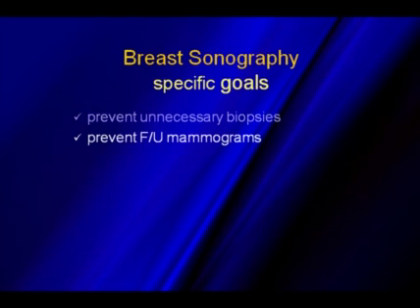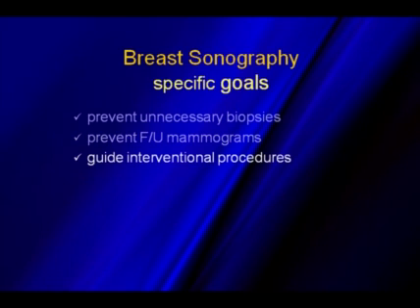We also try to prevent follow-up mammograms. It's amazing how many patients are afraid of the amount of radiation that they think they're going to get from a mammogram. So if ultrasound could answer their concerns or problems and additional views for the mammograms don't need to be done, that's a great goal that we can accomplish. We try and guide interventional procedures. If a lesion can be seen under ultrasound, it's going to be much easier to biopsy it under ultrasound guidance than it is with stereotactic methods.